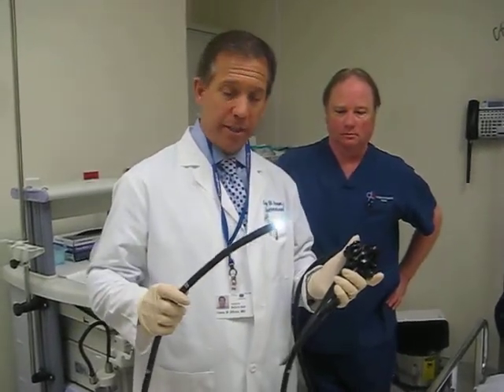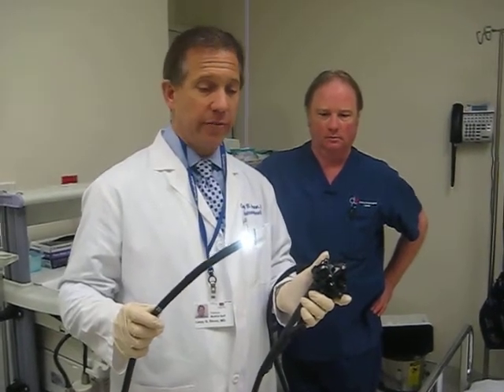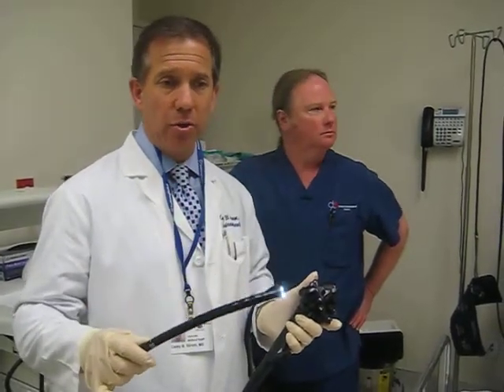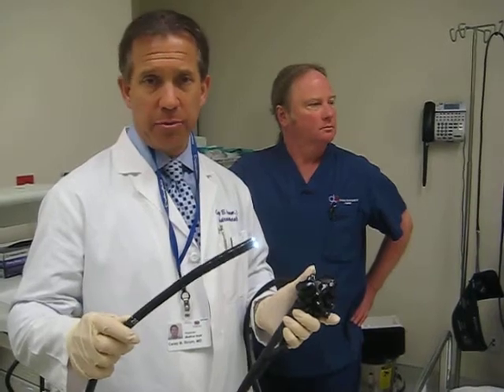This is colonoscopy, and everybody over the age of 50 should have one. If there is a family history, you normally do it 10 years younger than your uncle or your mom or your dad, just to prevent any type of problem in the future.